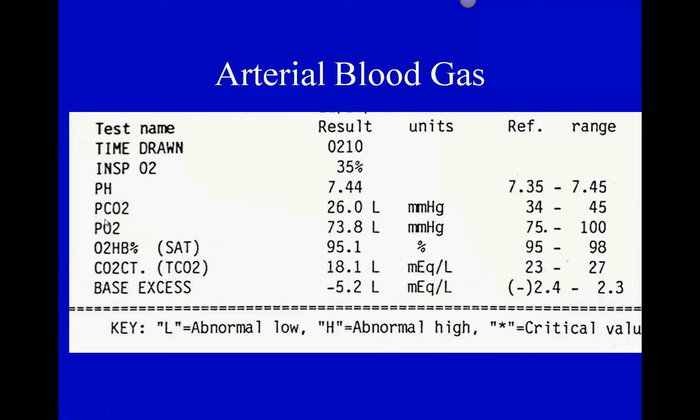So when I'm looking at a blood gas, and I said we're going to look at the carbon dioxide level, that's pretty easy to identify, but don't get it mixed up with this one. When we talk about carbon dioxide and we're looking at the ventilation piece, we're looking for the one that's the pressure measurement, millimeters of mercury. When we look at acid-base balance and the ability of the kidneys to get rid of waste products, we're going to look at this bicarbonate or total CO2.